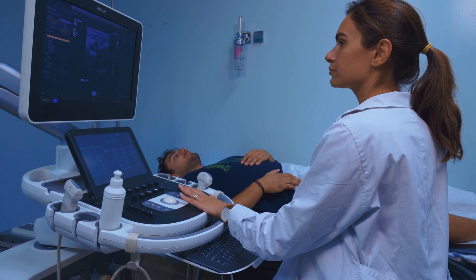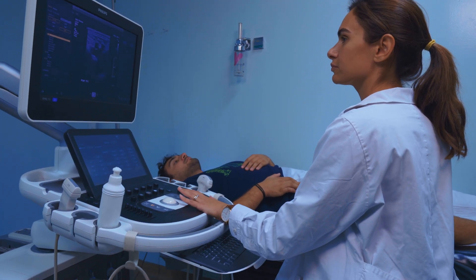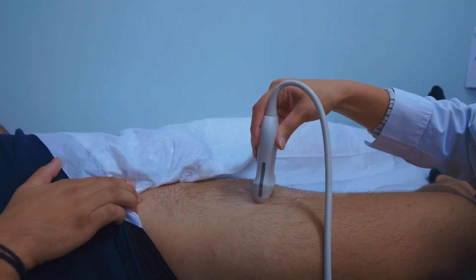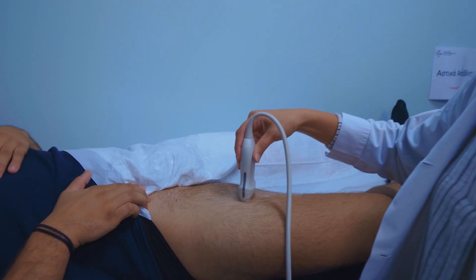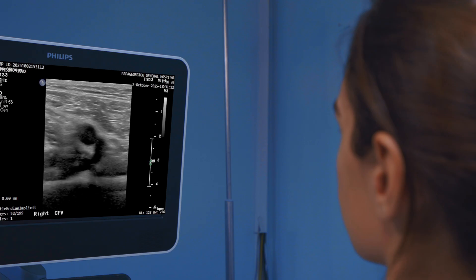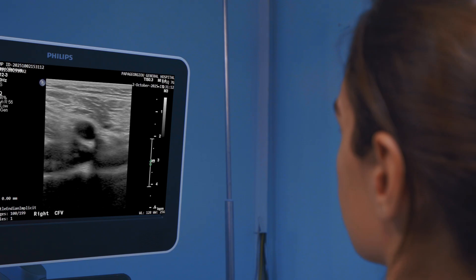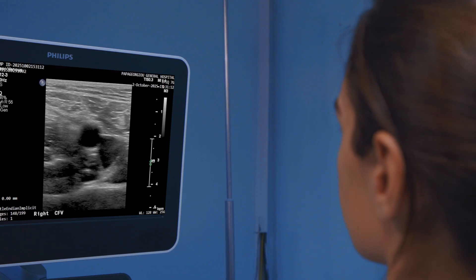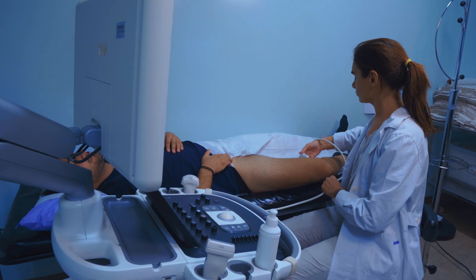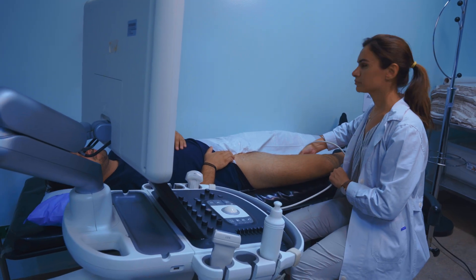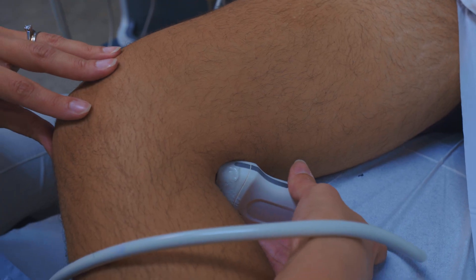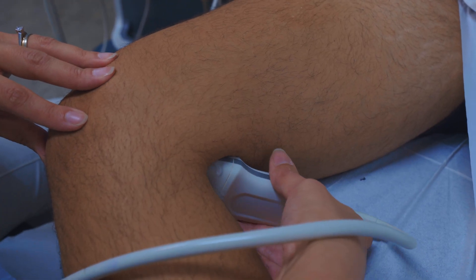The physician then systematically moves down the leg, performing the critical vein compression test at each scanning location. This maneuver assesses the vein's response to external pressure from the ultrasound probe, a standard practice for evaluating vein wall integrity and patency.